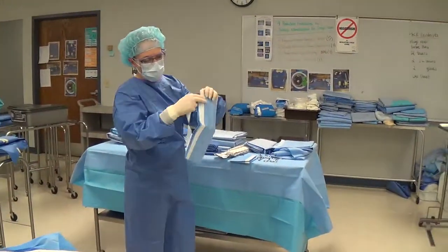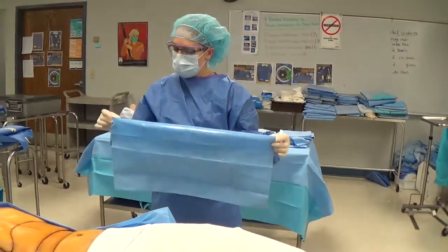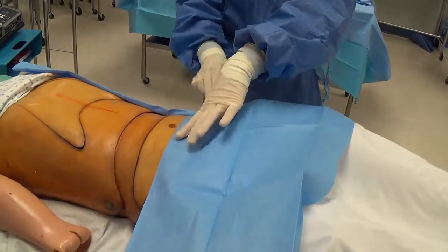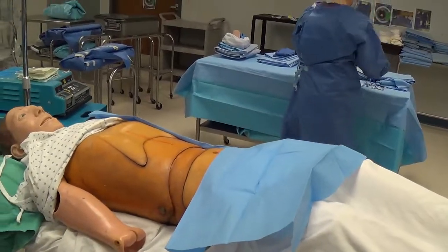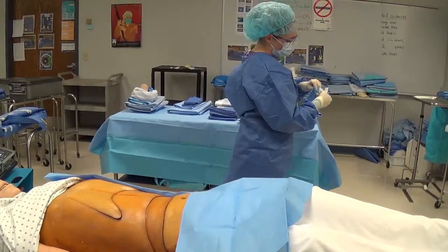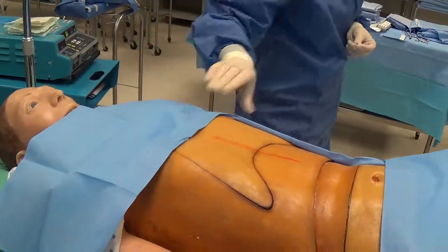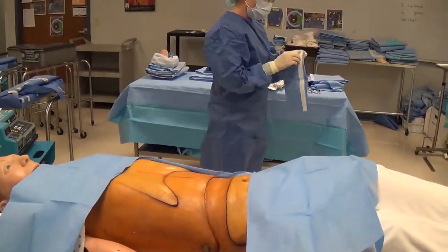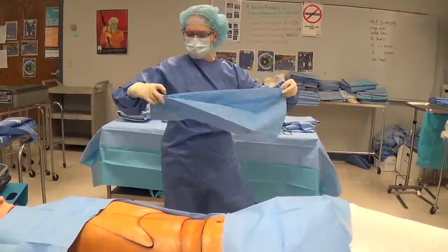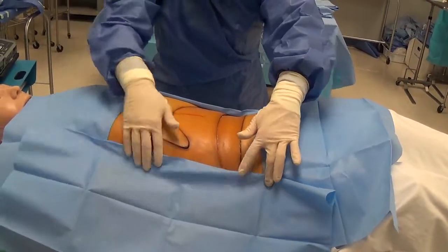Do the top or the bottom next — open it up, swing out, and place it sticking down immediately surrounding the incisional area. Place the top towel, stick that down, and then on the last one the fold goes towards you, just like with regular linen towels. Reach across making sure you stay high enough that it doesn't drag on anything, and stick that down.